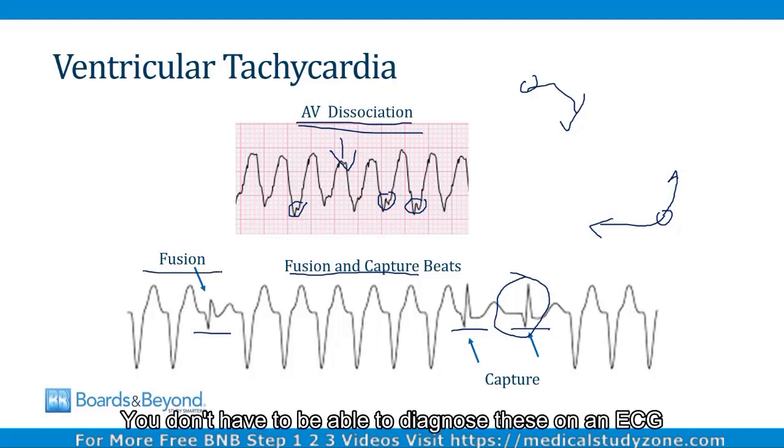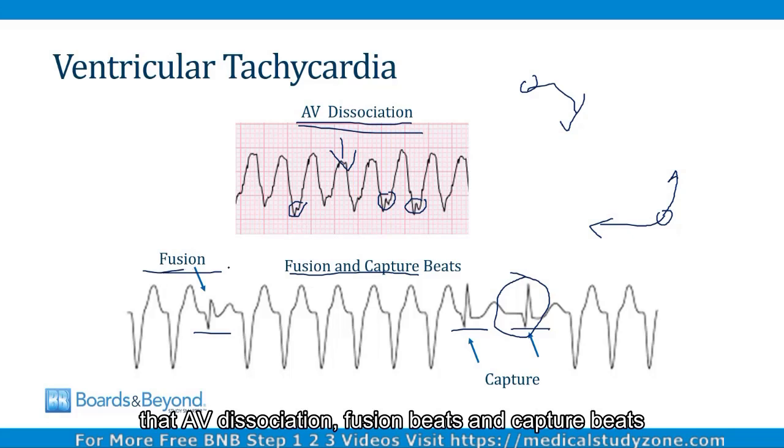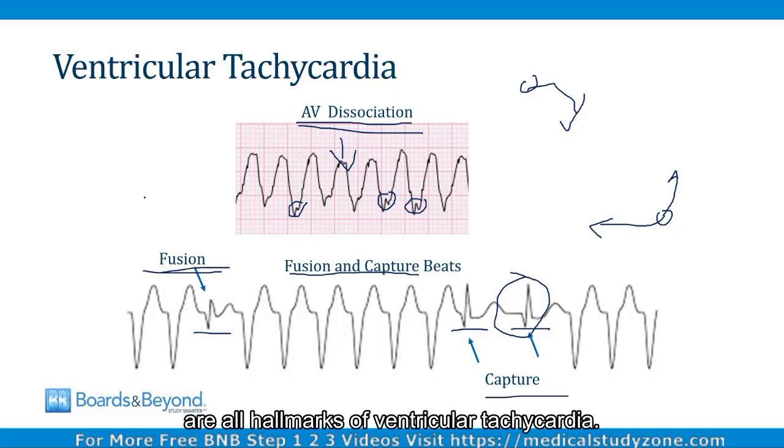You don't have to be able to diagnose these on an ECG. As a med student, it's very difficult to do, but you should know for your boards that AV dissociation, fusion beats, and capture beats are all hallmarks of ventricular tachycardia.